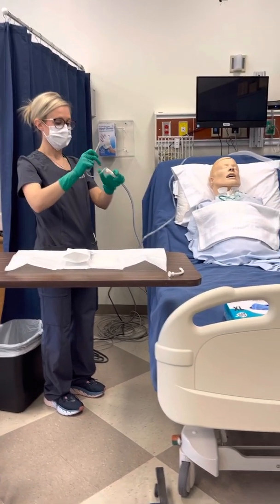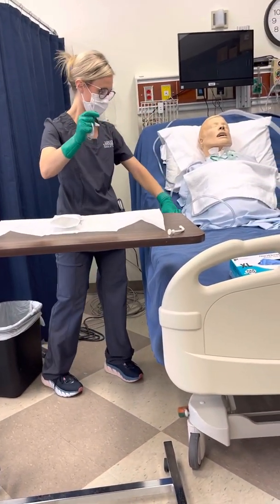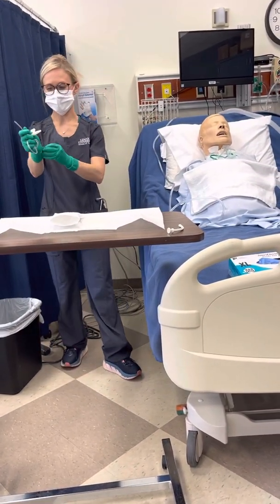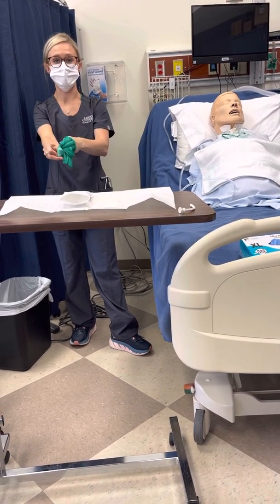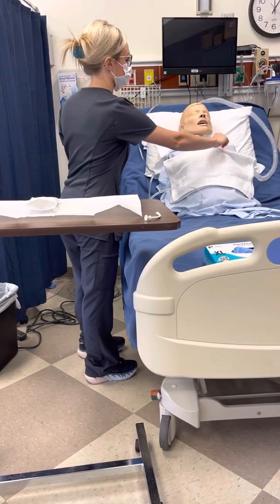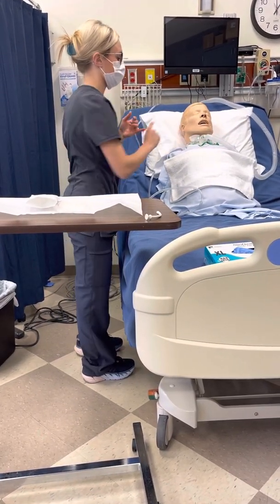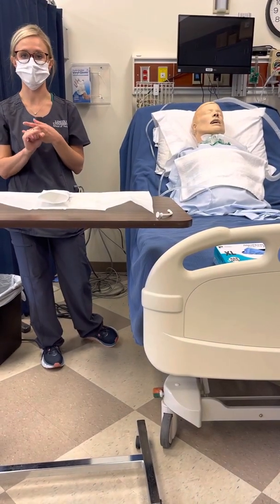I am now going to remove this. When I'm finished, I'm going to make sure that I document how well my patient tolerated this suctioning. I'm going to document if the patient has any secretions, the characteristics, the color. I'm going to document his respirations after suctioning.